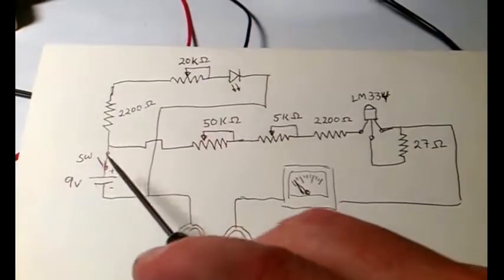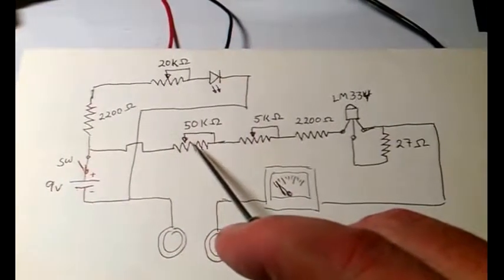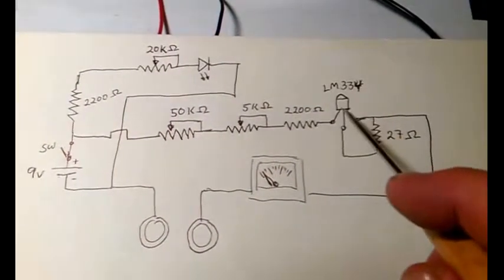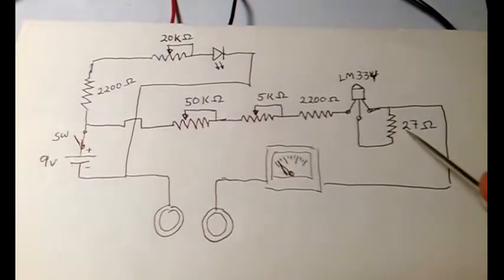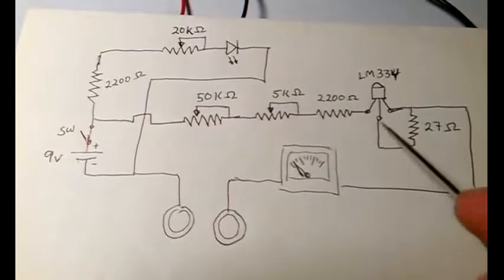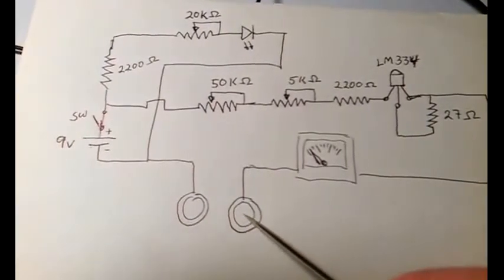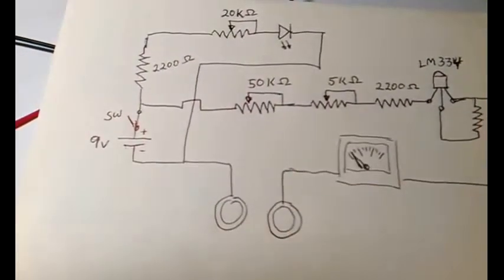The TDCS circuit goes after the switch through a 50K potentiometer, then a 5K potentiometer, and then a 2200-ohm resistor, into pin 1 of the LM334 current regulator. And then out of pin 3 of the LM334, you have a 27-ohm resistor, which goes back to pin 2. So this is the regulating loop for the current regulator. The output from pin 3 goes down to the 3 milliamp meter, and then out of the meter into the anode electrode, through your head, to the cathode electrode, and then back to ground. And voila, that's it.